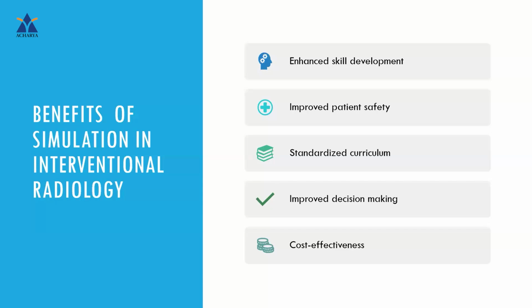You can minimize the risk to the patient during training using simulation, and you can enable trainees to learn from mistakes in a controlled setting. You can also expose the person to diverse scenarios, replicating a wide range of clinical situations, including rare and complex cases. And you'll have a standardized curriculum.